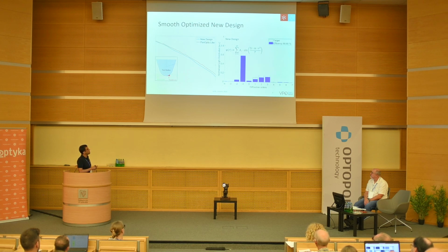It turns out that this design can be modeled by a sine series. For this one, I need to use like 27 coefficients to properly model it, but it can be analytically described with this type of formulation. And with 27 coefficients, I already have like 99.99% of the profile well described.